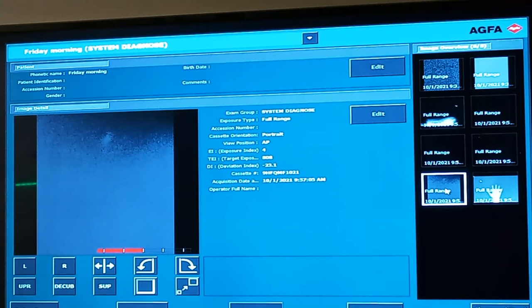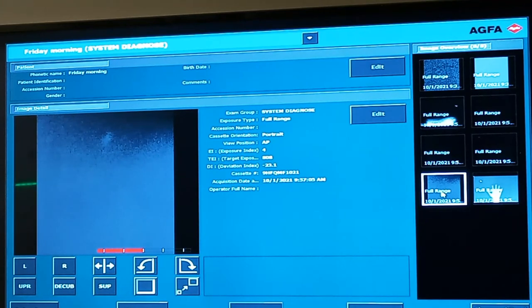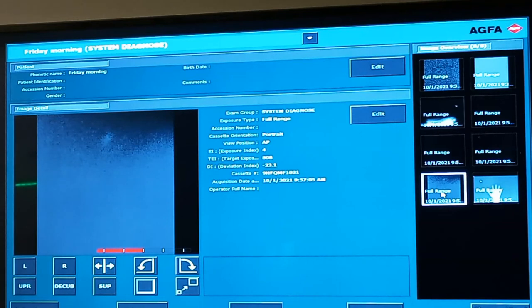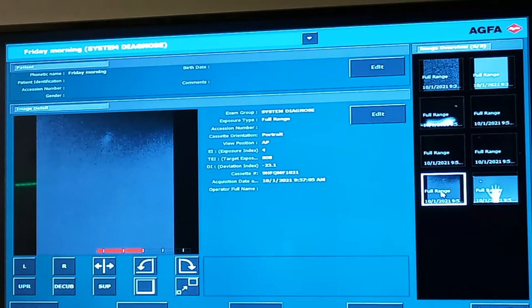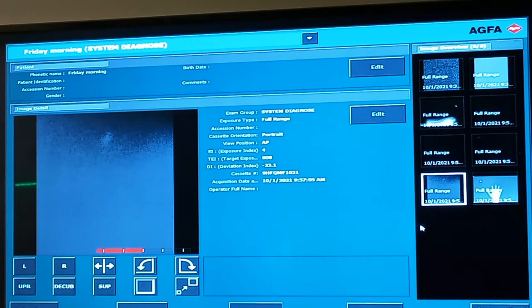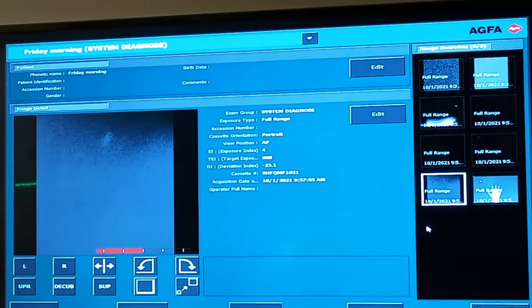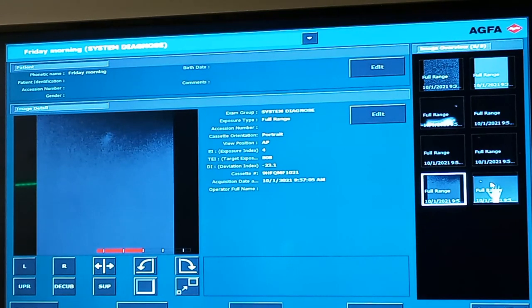Exposure is always cumulative. So this didn't eliminate all the exposure, but it cut it way down. We got an exposure index here of four, but we had a range of only six feet. So that's significant. Bring up the next image.